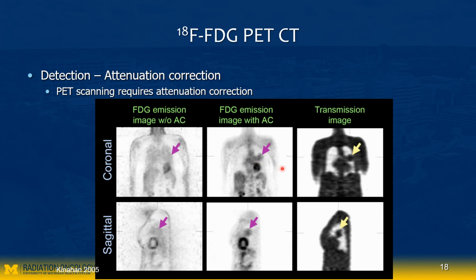So I mean, it's rather the other way. You have to give less weight, right? So okay, now the signal strength that is coming from the lung will be corrected for its attenuation. Okay, I hope it makes sense. So the way it creates this attenuation correction map, traditionally for PET, was using this germanium-68 isotope.